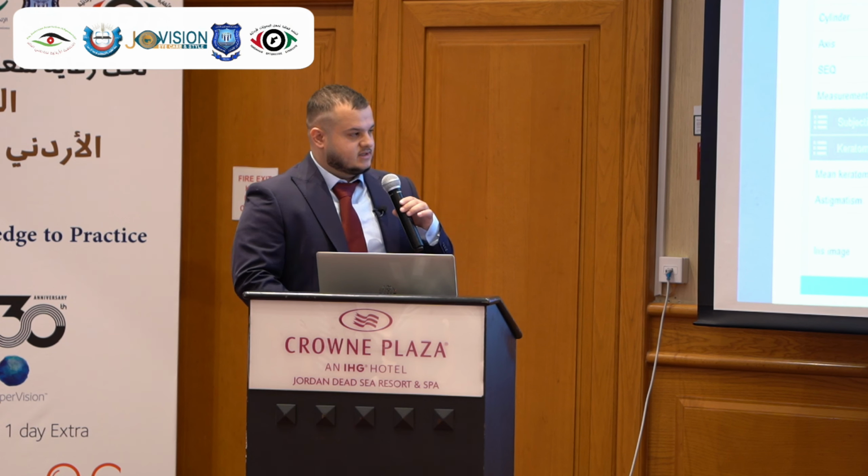By the way, based on these parameters, we suggested that parents and patient consider starting with Ortho-K, as it is our duty as optometrists. When measurements indicate that by age 22 it will be minus 5 diopter, it's essential to prevent progression and minimize the risk of developing refractive error and related disease. Our goal is to protect the patient's vision.